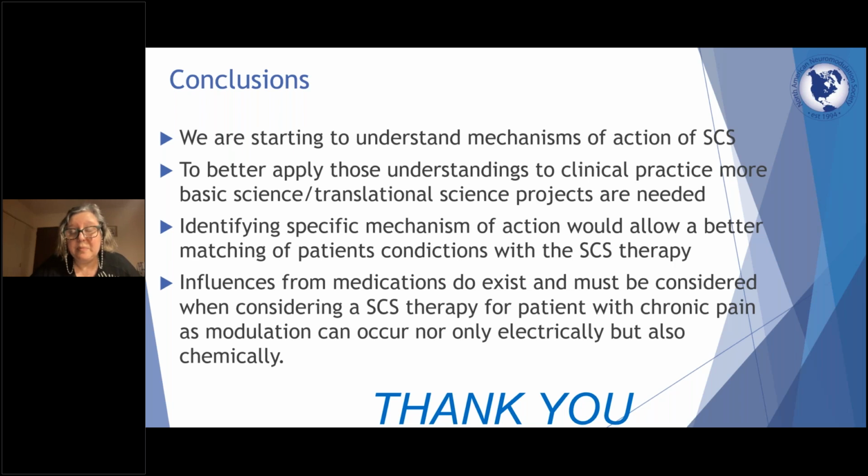Despite the fact that neuromodulation is more than 50 years old, we are still learning and trying to understand the actual mechanism of action by which patients we implant with a spinal cord stimulator are having so much pain relief. Keep in mind that there is a correlation between the medications we use and spinal cord stimulation, and they can be synergistic or antagonistic depending on the medications. Another mechanism is on the way to being elucidated in the near years.